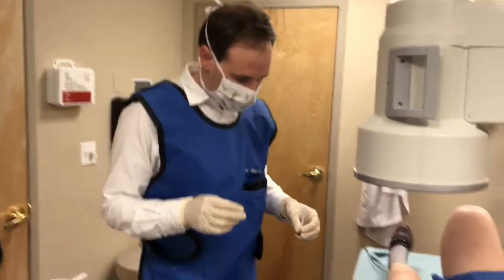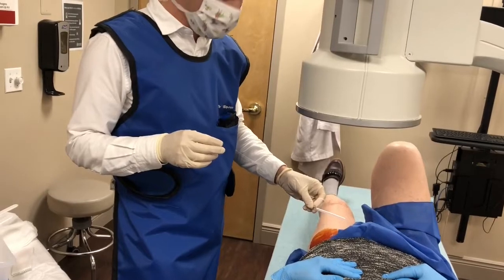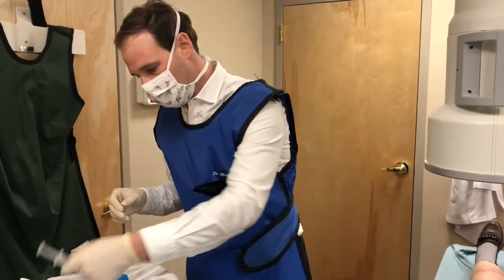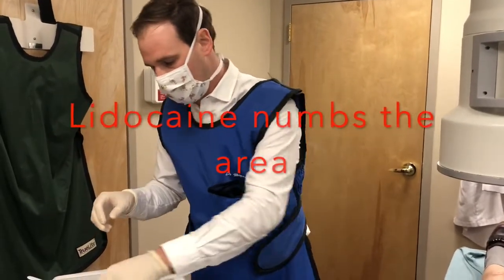This is the needle we're going to use, but first we're going to numb the skin with a little bit of lidocaine. I take one shot first at the hip to make sure that we've got the needle in the right spot, and then we're going to administer a little bit of lidocaine here.